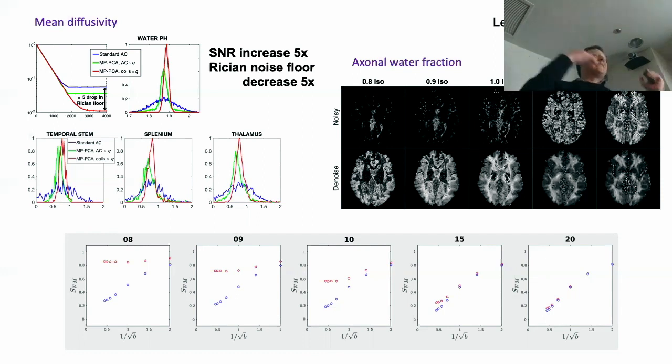Yeah, sure, I can stay in the complex phase, yes. But does that mean the result is better? Well, it's hard to tell. No, it's better because there is no Rician floor, but the point here is that it's better than using every image separately. The redundancy, if you have the whole q-space stack, allows you to remove more noise than you otherwise would.